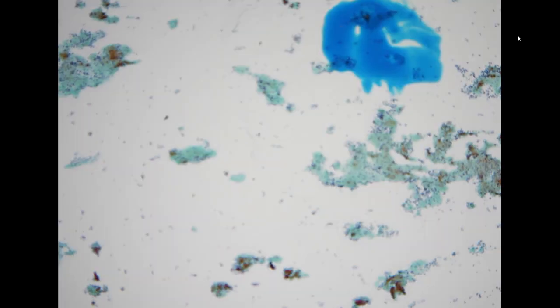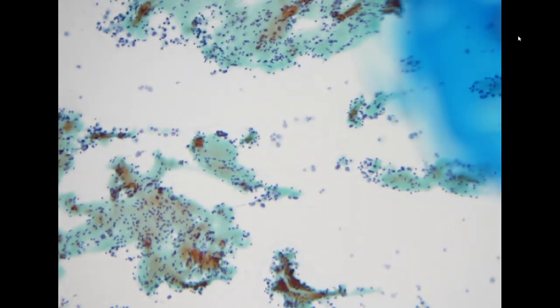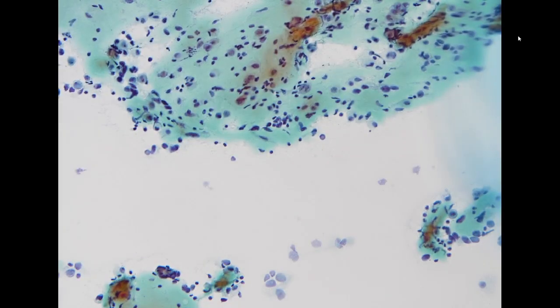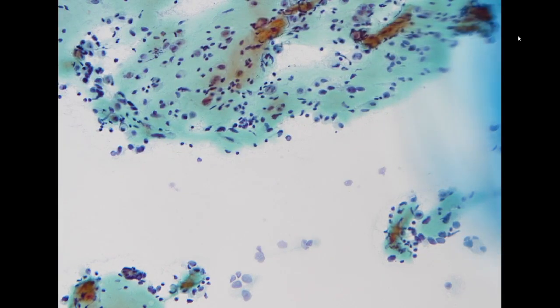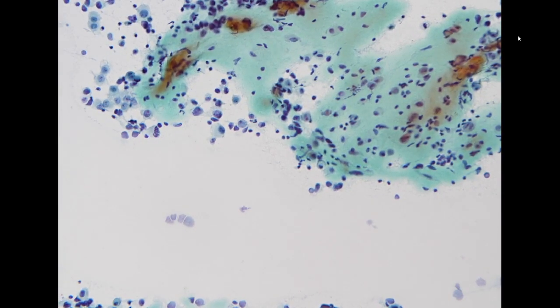So I requested to retrieve the slides. As you can see, this is even more difficult to interpret. Sometimes the preparation is not optimal, and it's not very easy to confirm if there is a tumor or not.